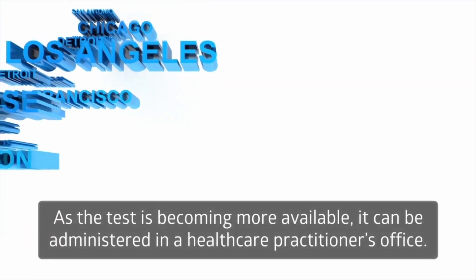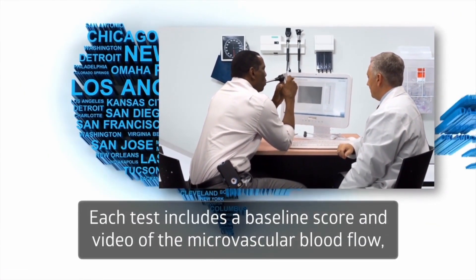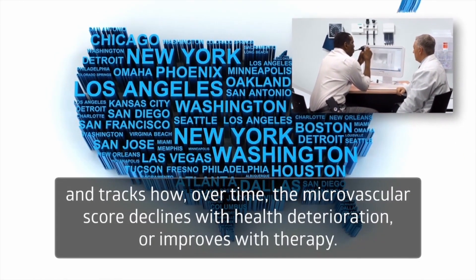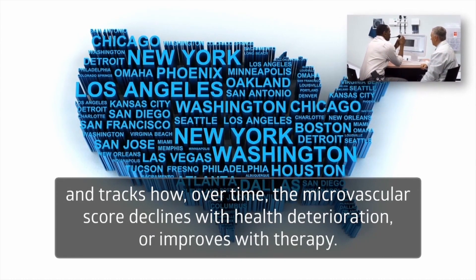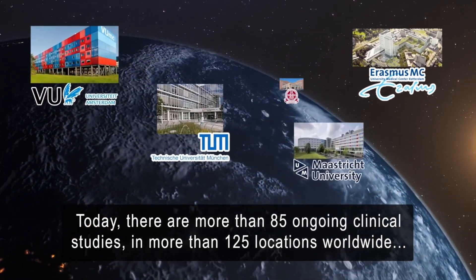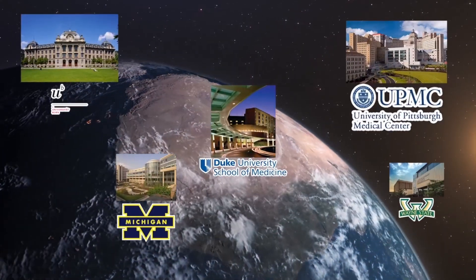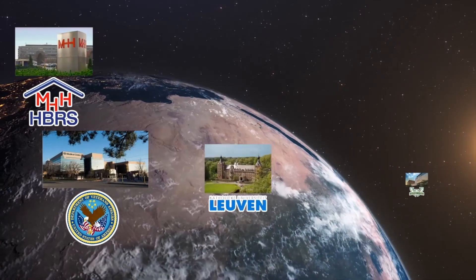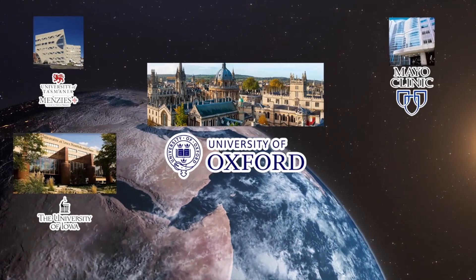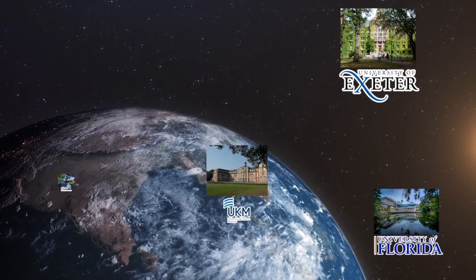As the test is becoming more available, it can be administered in a healthcare practitioner's office. Each test includes a baseline score and video of the microvascular blood flow and tracks how, over time, the microvascular score declines with health deterioration or improves with therapy. Today, there are more than 85 ongoing clinical studies in more than 125 locations worldwide, such as Duke University, University of Pittsburgh Medical Center, VA Hospital of Salt Lake City, Children's Hospital in Philadelphia, the University of Oxford, Mayo Clinic, Leiden University Medical Center, Steno Diabetes Center, University of Exeter, and dozens more.